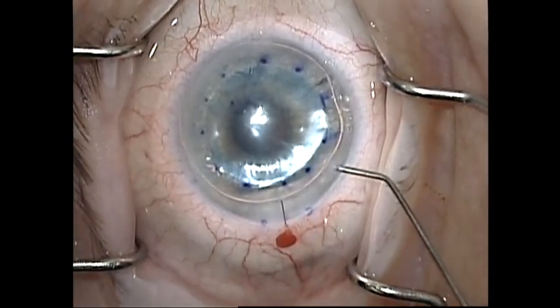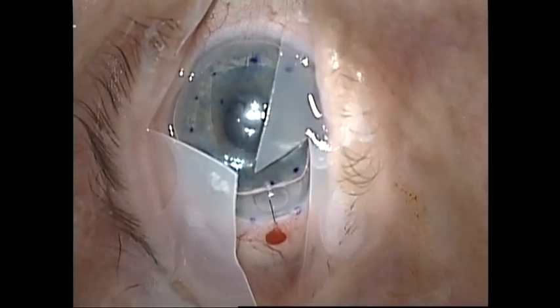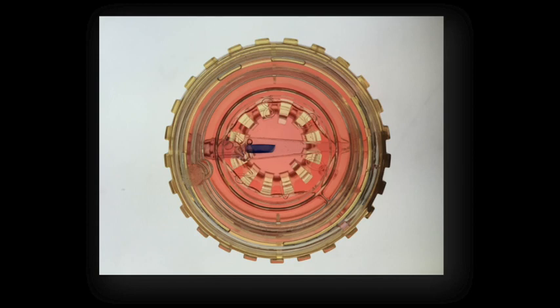Following that two-minute time out, I adjust the size of the bubble to approximately 90% of the anterior chamber at a normal intraocular pressure and I ensure that the bubble will not block the peripheral iridotomy. At this point the case is completed and the patient is sent to the post-operative recovery area where they will be examined in approximately one hour to make sure that there is no pupillary block, the bubble is freely mobile, and the peripheral iridotomy is open.